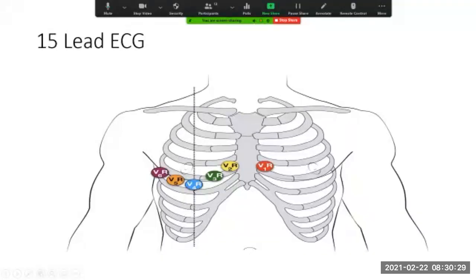So we said now that we have a right-sided MI. How do we confirm it? The way that we confirm it is by doing something called, sorry, it's not a 15-lead ECG, it's an 18-lead ECG. You guys have done ECGs before. Normally what we do, we put V1, V2, V3, V4, V5, V6. The reason why we do that is we want to look at the left side of the heart because that's where most of the damage has happened. Now in this case, we are suspecting that something may have happened on the right-hand side as well. So the only thing that we do is switch the leads around, and we put them in the exact same order, but on the right side of the chest.